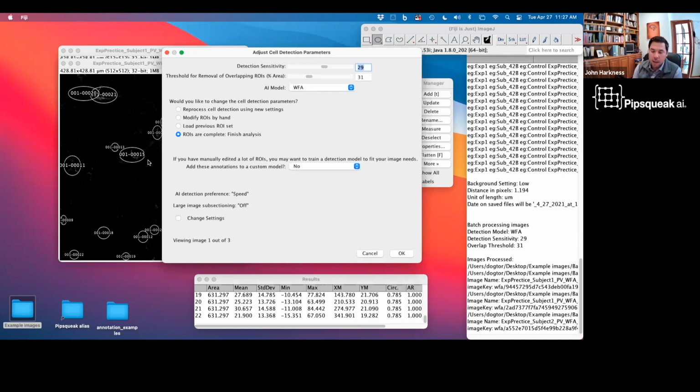And, I don't think that I can make a blanket statement that it's always appropriate to measure intensity. Certainly with techniques like DAPI, or not DAPI, DAB staining, I don't think measuring intensity is probably appropriate, but, I'm not an expert in DAB. So I think it really comes down to the type of stain that you're putting onto the image and whether or not that's a good one to use.